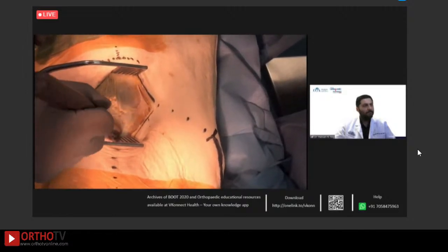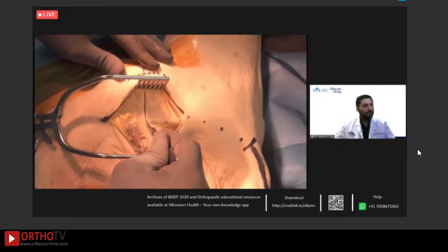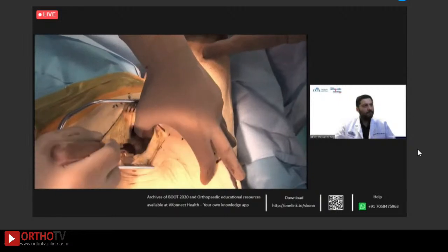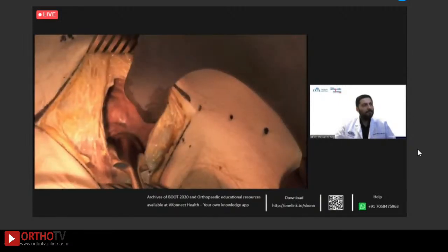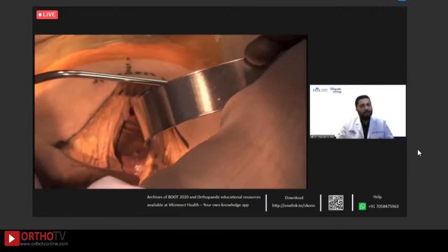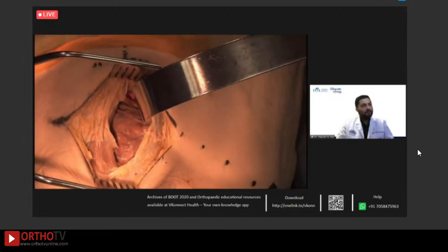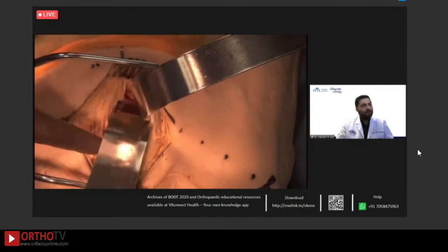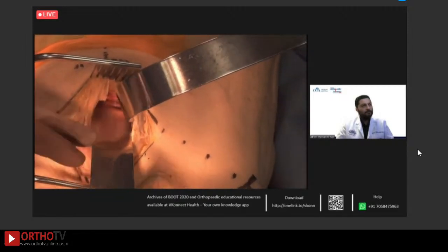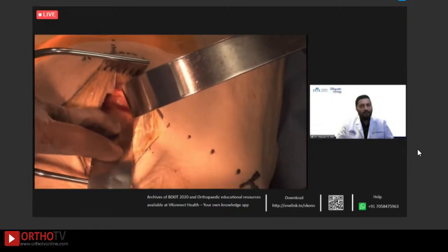The fascial midline can be further identified by the crossing fascial fibers of the external obliques. It's important to gain vertical length to allow for a long split to aid in intrapelvic visualization. Blunt dissection is carried out between the left and right rectus abdominis muscle bellies and into the space of Retzius to avoid injury to the bladder. A Deaver is used to retract the rectus. A moist lap as well as a malleable retractor is placed to protect the bladder, with care to avoid injury to the neck of the bladder.